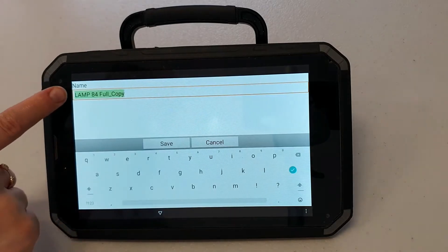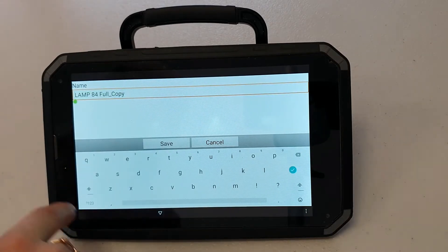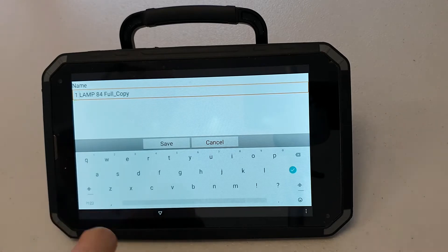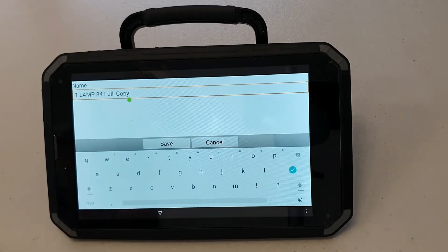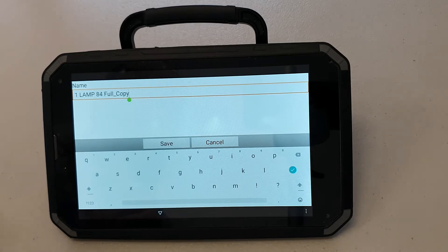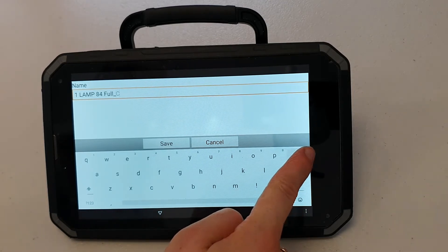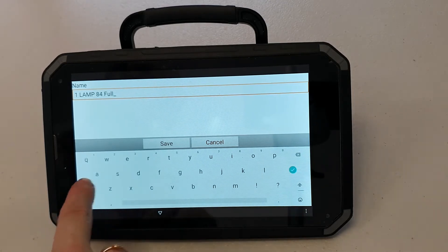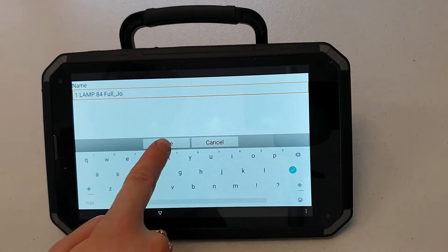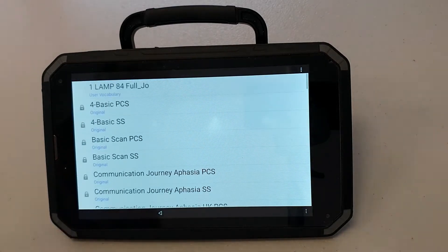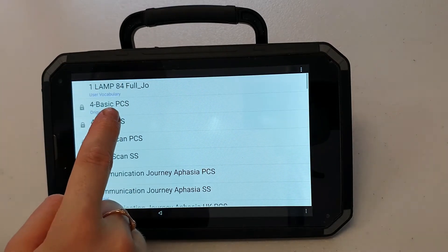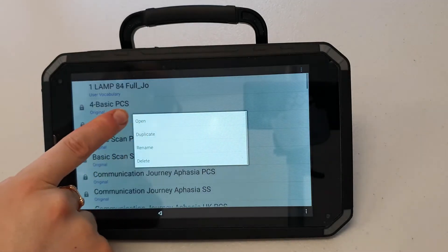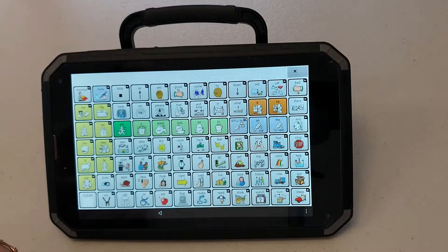I'm going to put a number at the start. The number will make sure that my customized vocabulary file appears at the top of the screen. I'll then just put my name there so I know this is my file and then I'll press save. My file will then appear at the top of the screen. I can open it now and begin making changes.